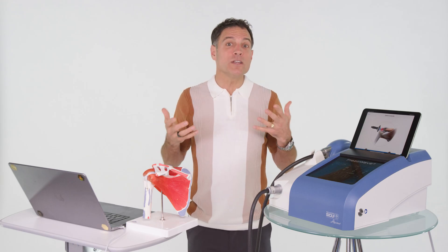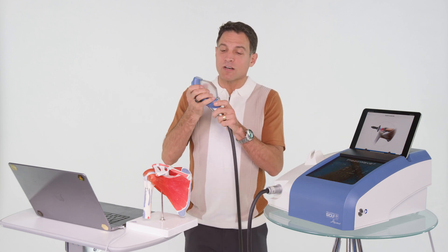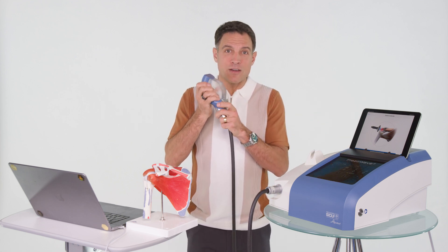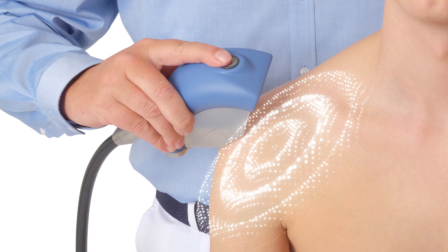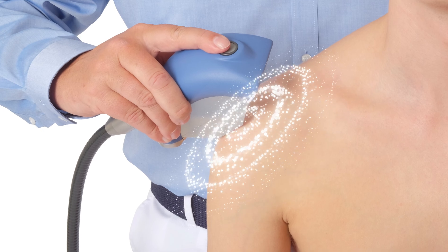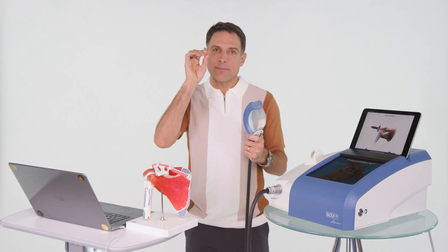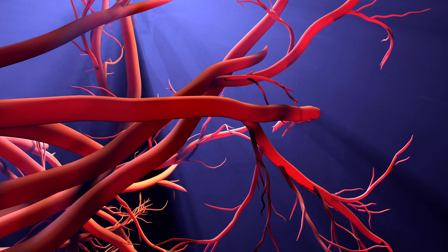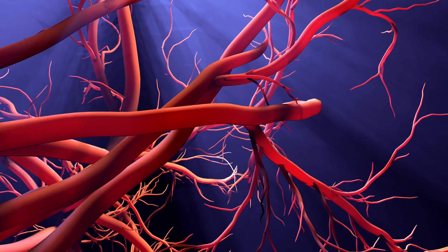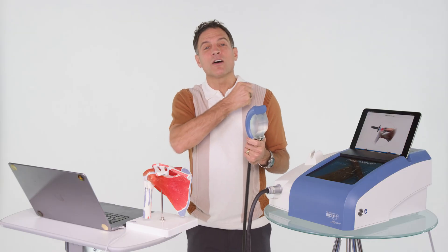So what we do with this machine is incredible. This is called the piezo wave — it is low energy focused shock wave. I can send a precise blade of sound into your tissues, for example the biceps tendon, and it'll go in there and break up scar tissue, send new blood vessels into the area, and cause that tendon to heal and not pull so much on the labrum.